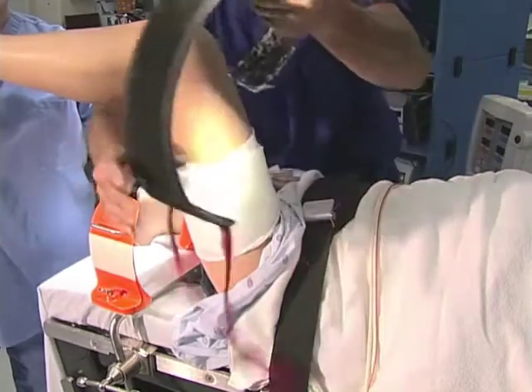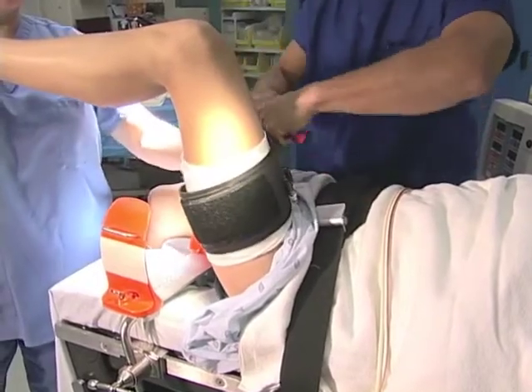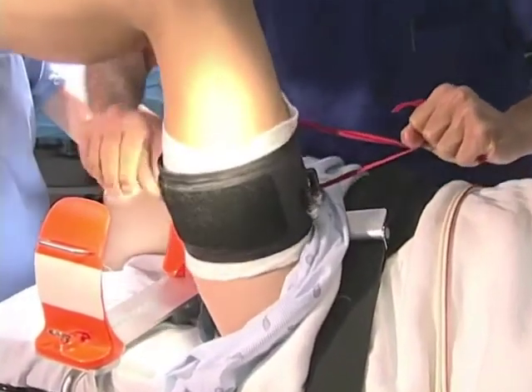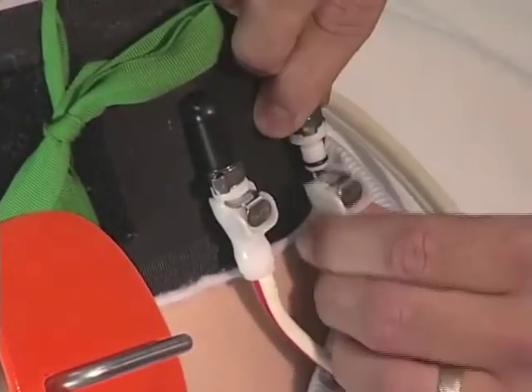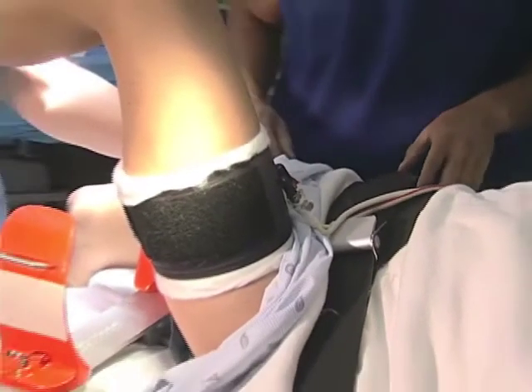We will place the tourniquet. The tourniquet is held in position with Velcro, and it's important to remember to put this high enough that after the patient is prepped and draped, it will be proximal enough on the thigh that there is room to work. Generally, we'll set the pressure to 350 millimeters of mercury for a normal adult male or female.